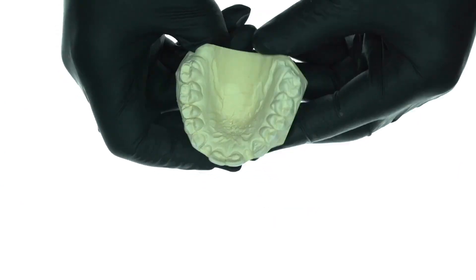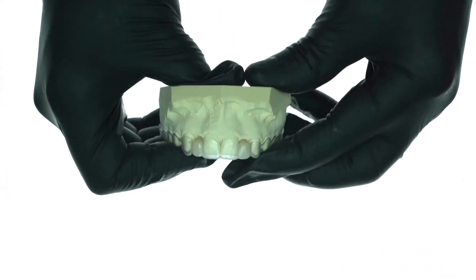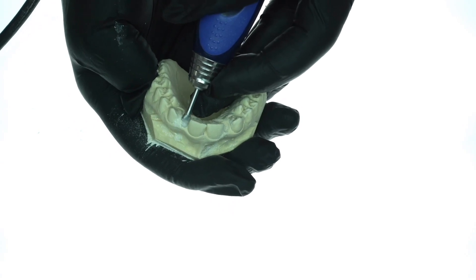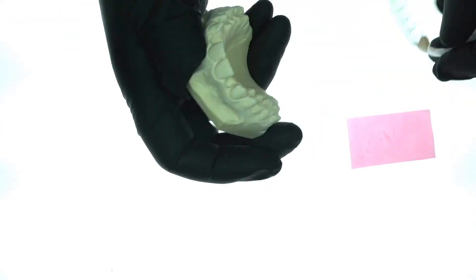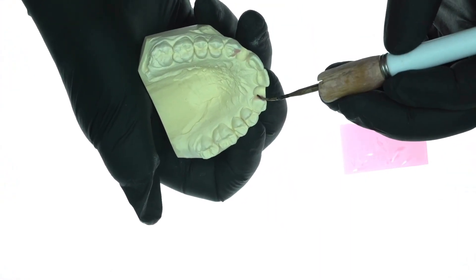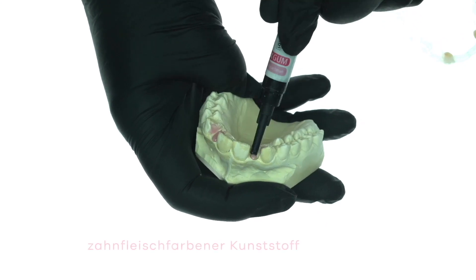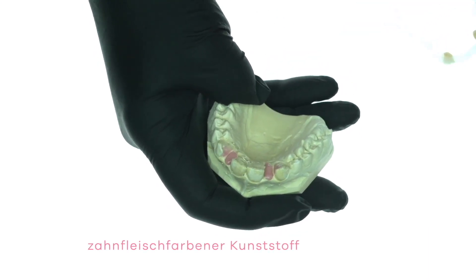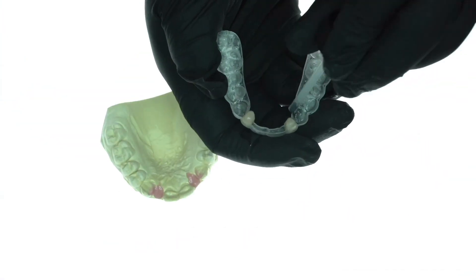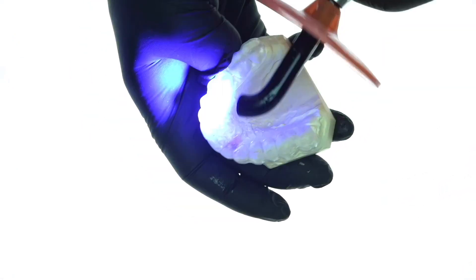Here you see the master model. The Duran foil from the patient with the shaped pontic is first tried, then the pontic areas are generously sanded free, and the foil is tested again. Then the sensitive areas are blocked out and isolated, and the remaining areas are isolated using vaseline. A gum-colored light-curing resin is then applied to the pontic area, and the splint is isolated. It is then released back onto the model and finally light-cured.